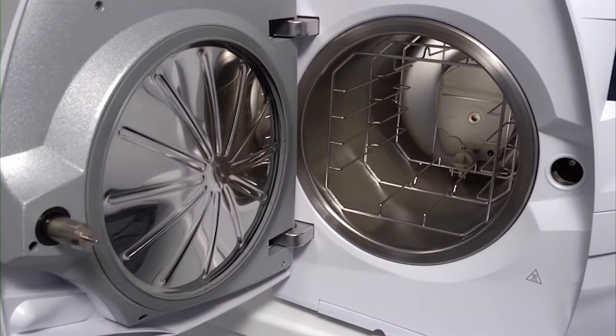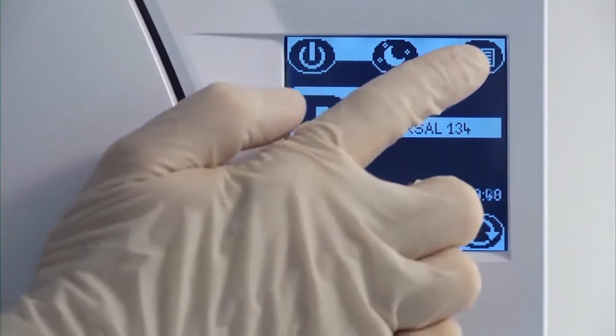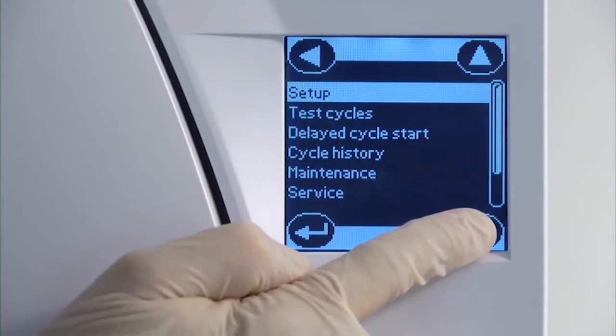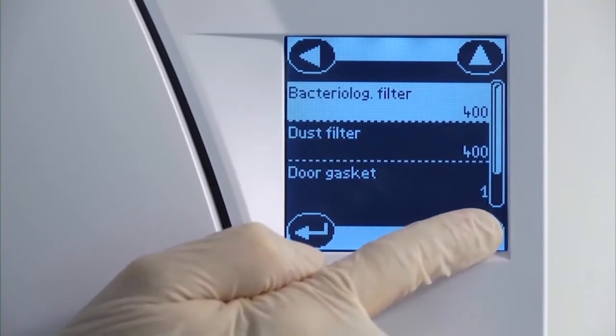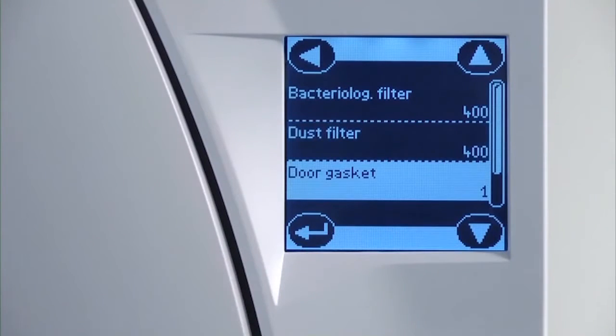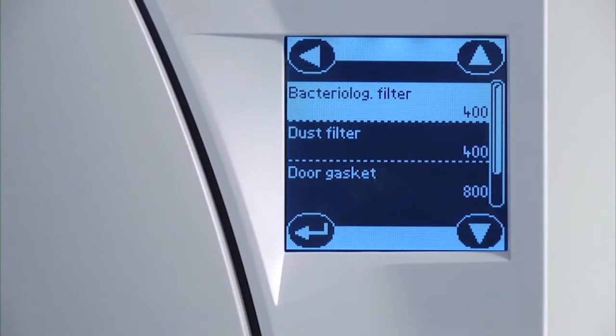Once your new door seal has been fitted, navigate to the maintenance screen within the menu. From here you can perform a manual reset of the door seal counter. Resetting the counter will ensure that the maintenance reminder automatically reappears after another 800 cycles have been completed.